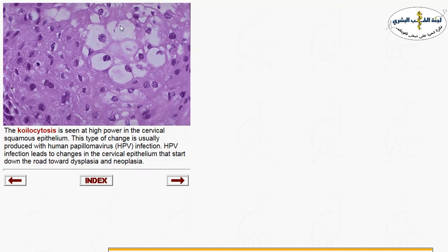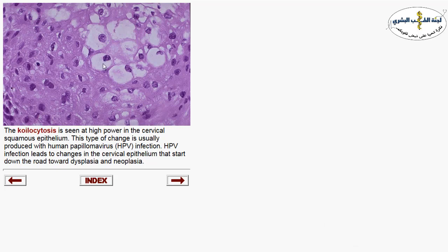One of the commonest viruses affecting the cervix is HPV — human papillomavirus. The changes seen are koilocytic changes within the squamous epithelium. Koilocytic changes are characterized by perinuclear halo clearing, nuclear indentation, and raisinoid-like nuclei — all due to HPV infection.